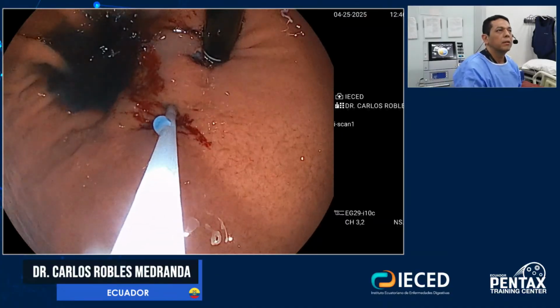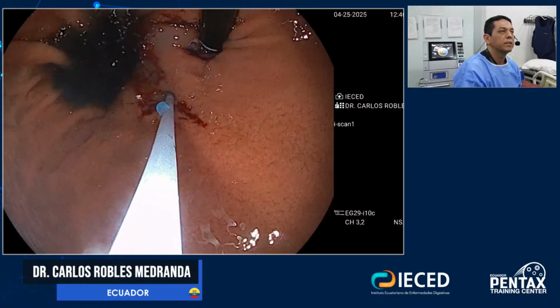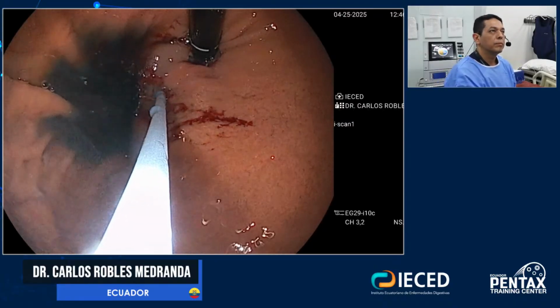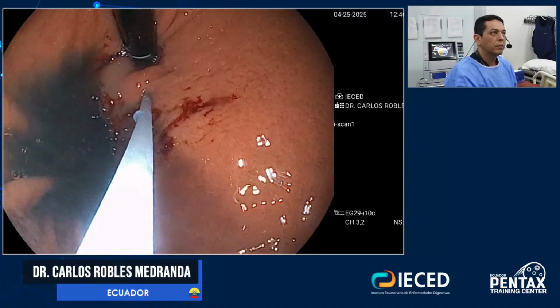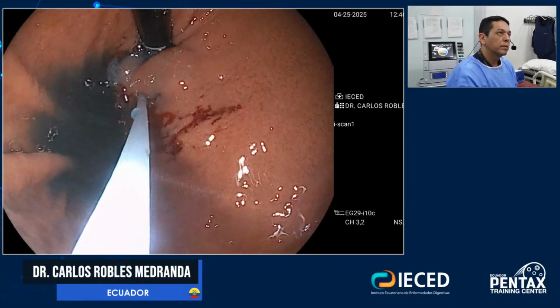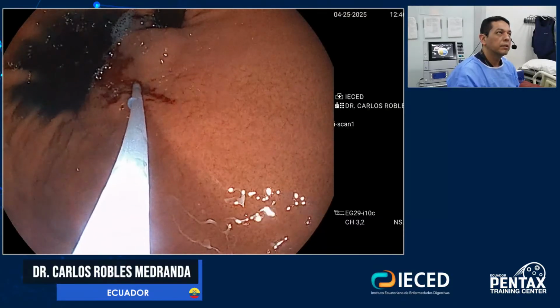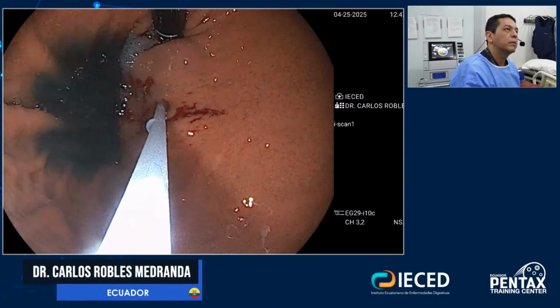Abre. Inyecta. Para. Inyecta. Momento. Abre. Inyecta. Sigue. Para, retira. Abre. Inyecta. Para, retira.